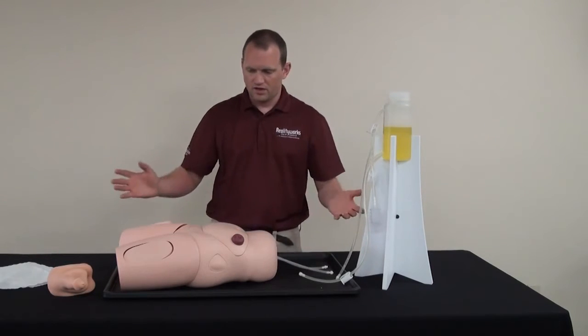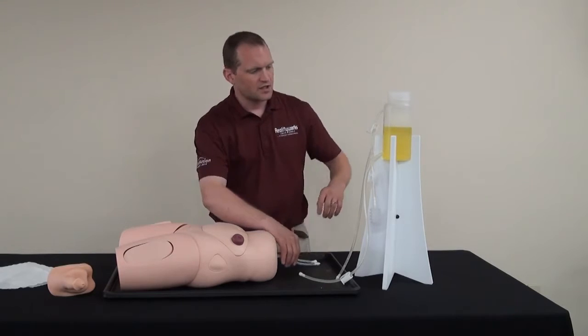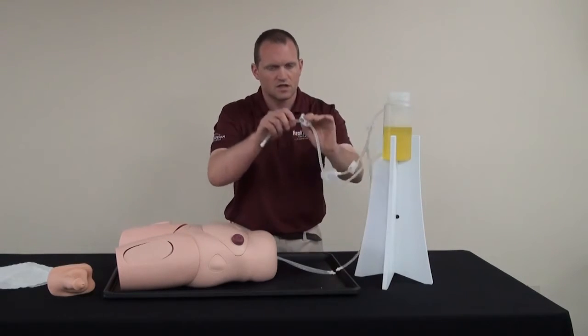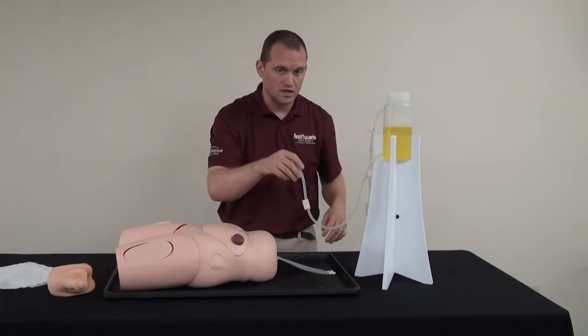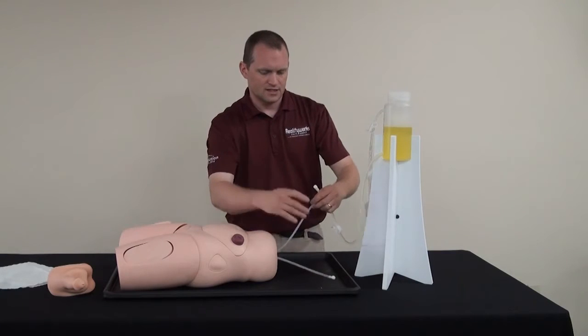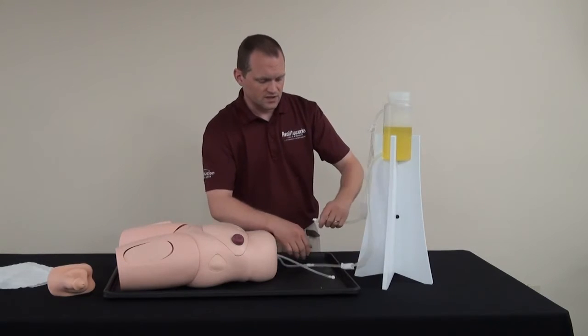After the catheterization model has been assembled, we are making sure all the clamps are secure in place. They are down so that none of the liquid can leak out, and then connect each hose — secure, but not overly tight.